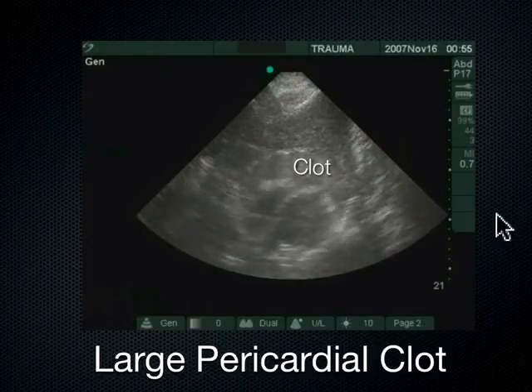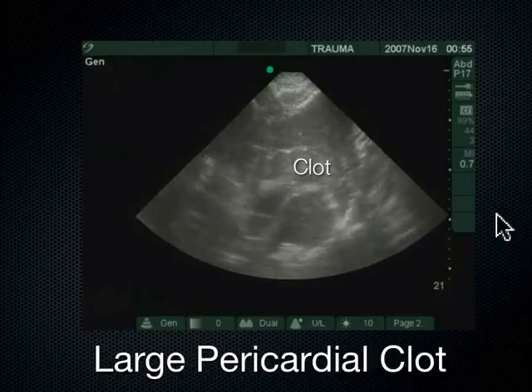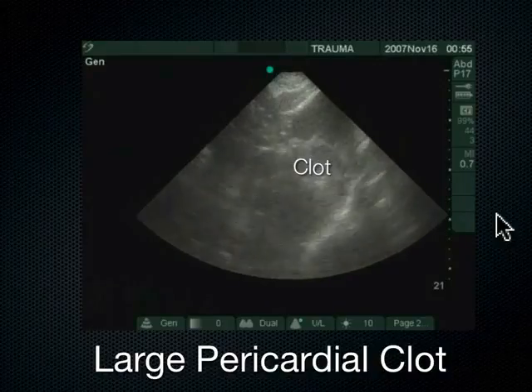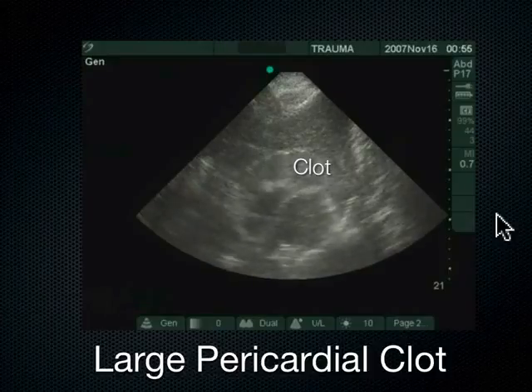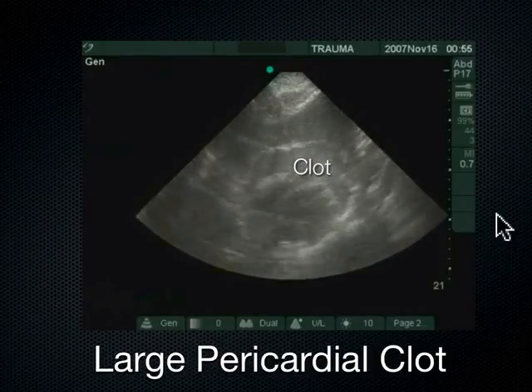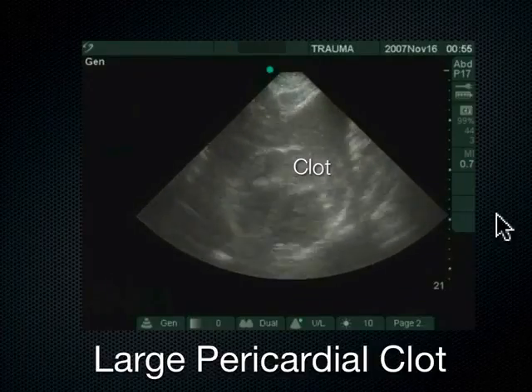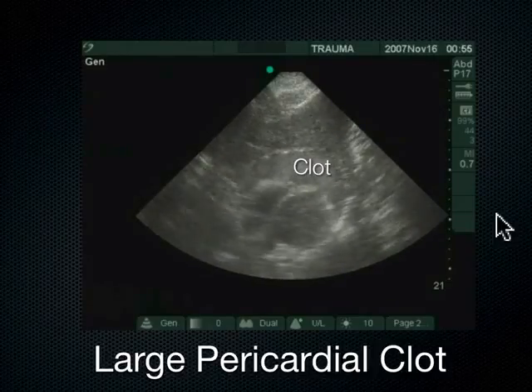The question is, what do you do if you have this and you're not at a trauma center where a trauma surgeon can come and bail you out of a thoracotomy? And I don't know the answer to that question. It's a tough question. It comes up when I'm teaching a lot. But all I know is that this really requires a surgical fix and not a procedural fix the majority of the time. If I were in a non-trauma center, I would do a pericardiocentesis, recognizing that it's likely futile, but who knows what you're going to get, and you can't kill a dead person.